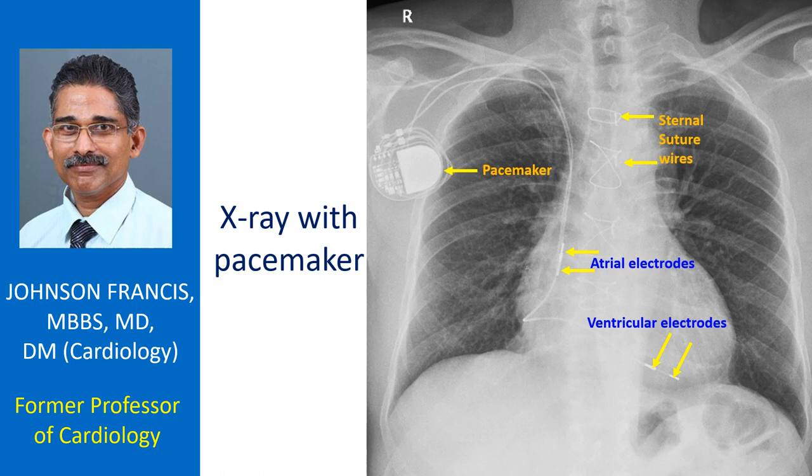Each lead has two electrodes — one at the tip and another a bit proximal to it — enabling bipolar pacing.